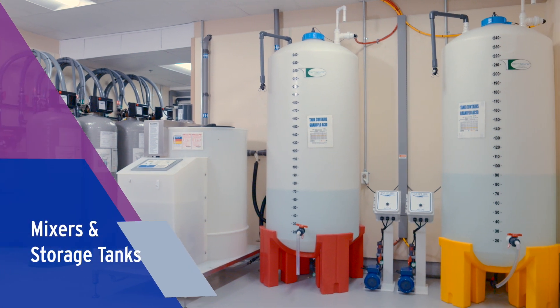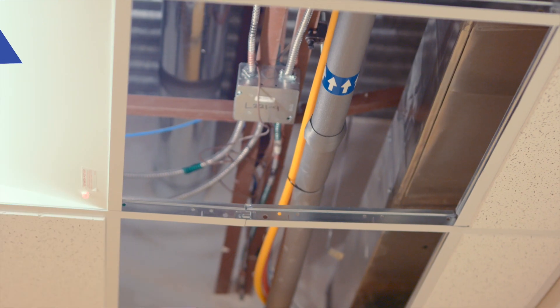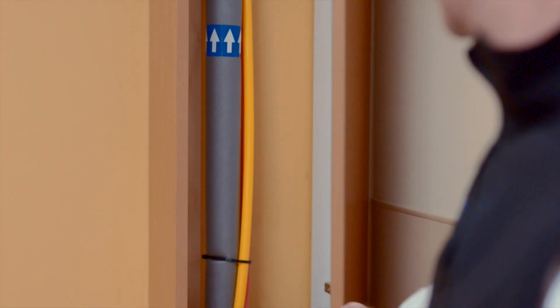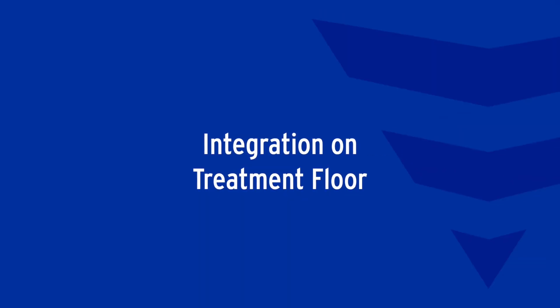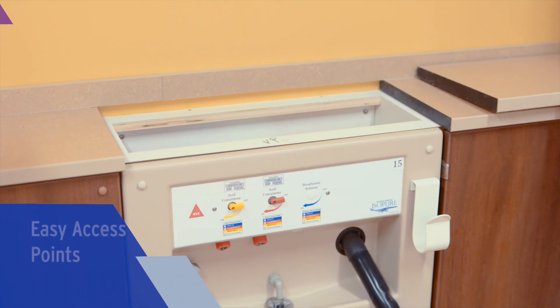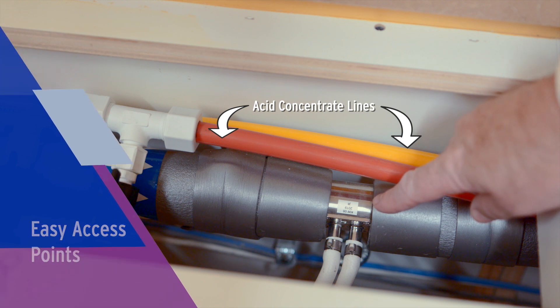Concentrate systems prepare and distribute solutions to the treatment floor. We neatly organize all overhead RO piping on the wall to help with troubleshooting. You'll find piping chases simple to reach with either hinged access doors or wall boxes. On top of each wall box, there is a removable top panel for easy access points to each concentrate line and corresponding valve connection.